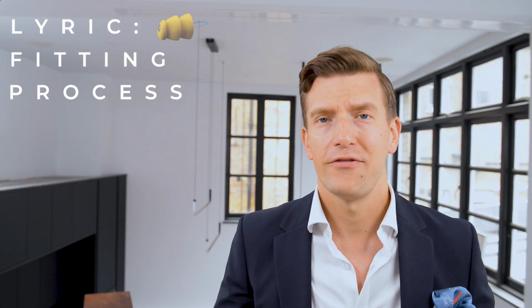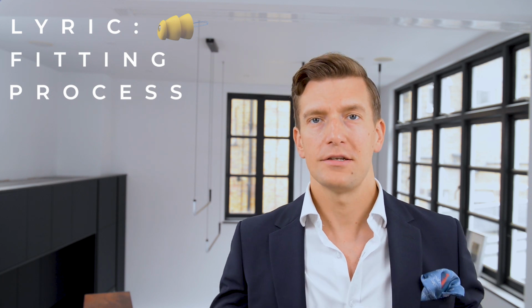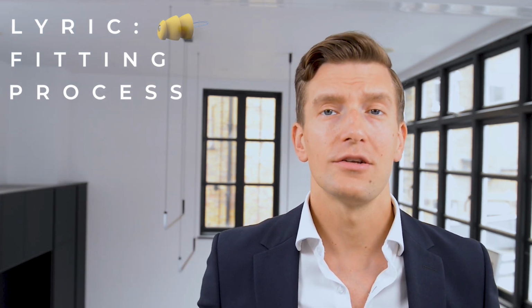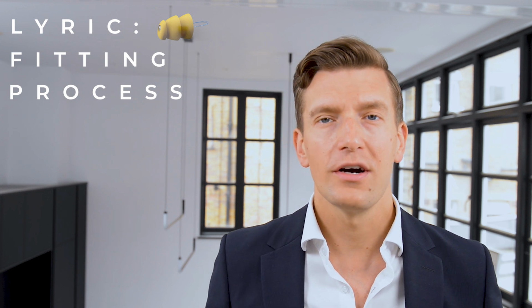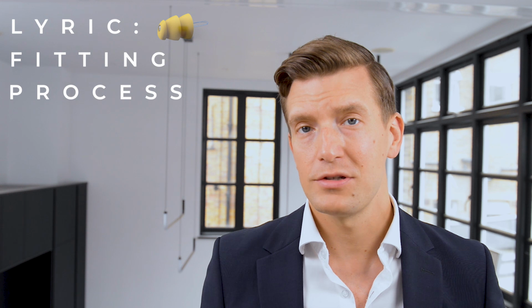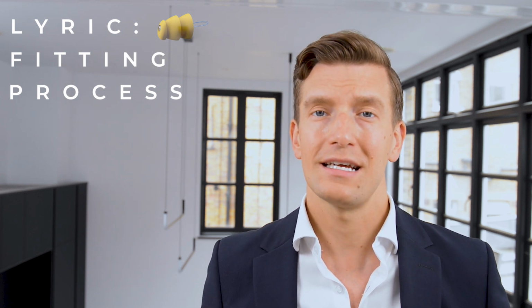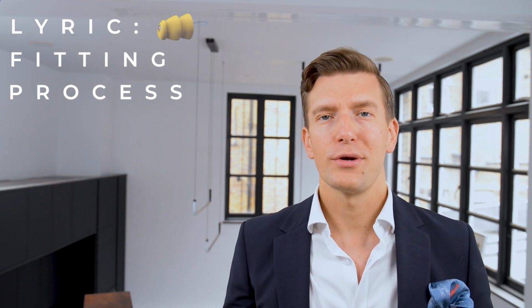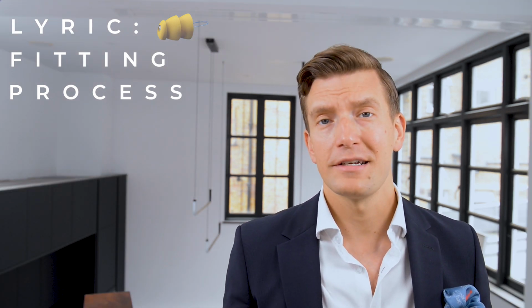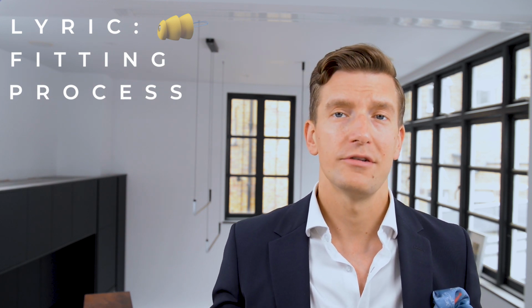The biggest challenge that I've faced over the years in terms of fitting Lyric is that not all ear canals are the standard Lyric shape. The positive thing is that over the years we've learned that you can modify and tailor some of the seals to be able to match even the strangest of ear canal shapes. And so there are solutions if your ear canal isn't designed for a normal standard Lyric shape. The measuring process actually takes place with dummy Lyrics, and then once we've established the correct depth and size, we go on and put a live Lyric in the ear.